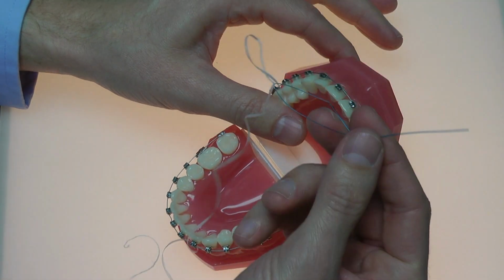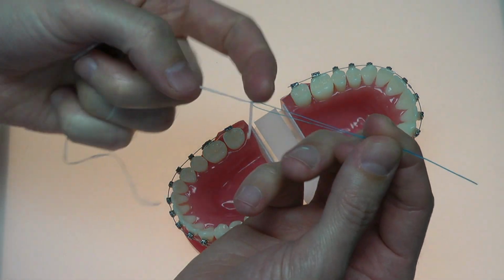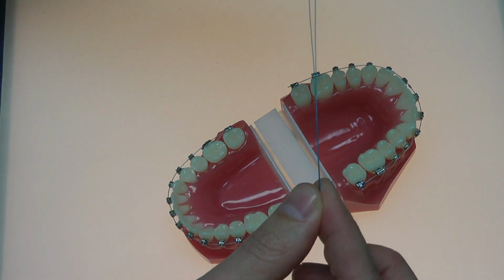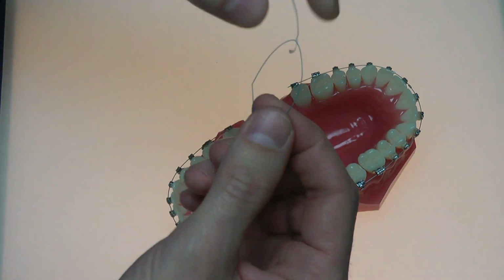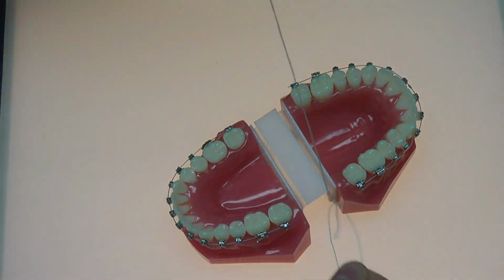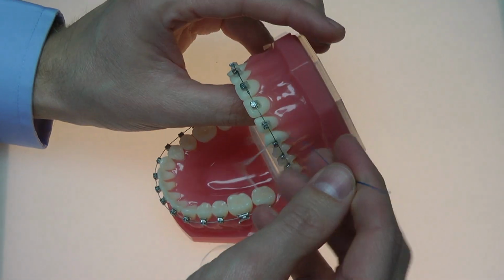As you can see on this floss threader, I've taken a piece of floss and I've tied a little knot around the end of the floss threader. A floss threader looks like a long, flexible plastic needle. So around the eyelet, the eye of the needle, I tied a knot in the floss. So now it won't fall off. Once I thread it through, it won't fall apart and I won't have to put it together again every time I want to floss in between a contact of my teeth.